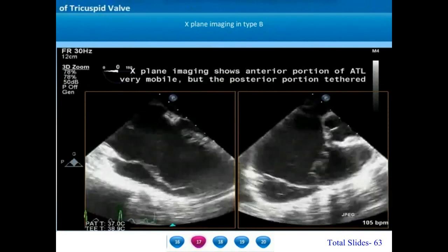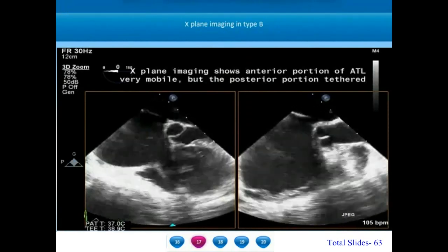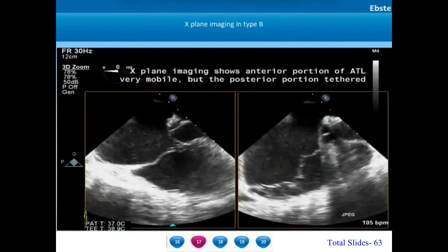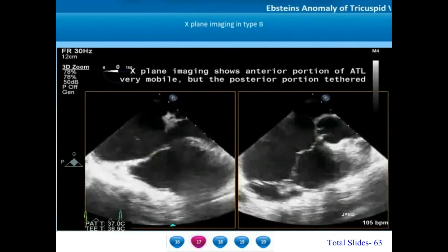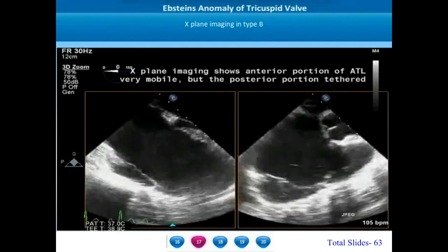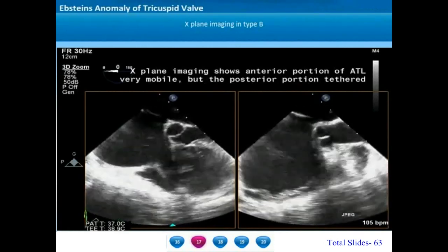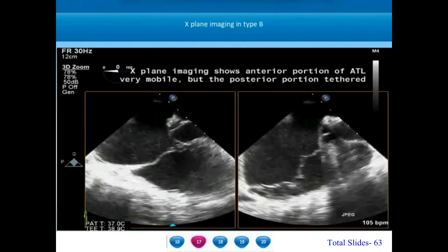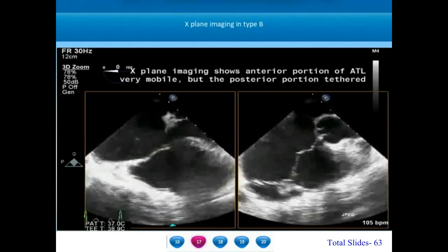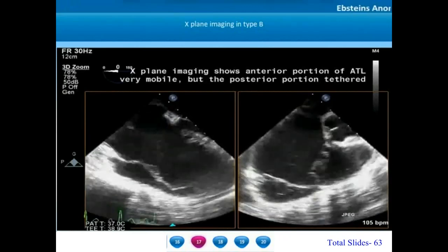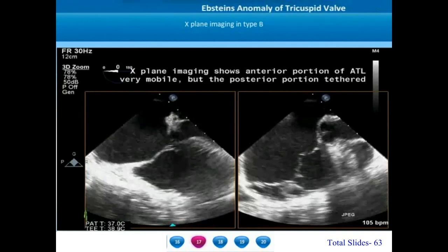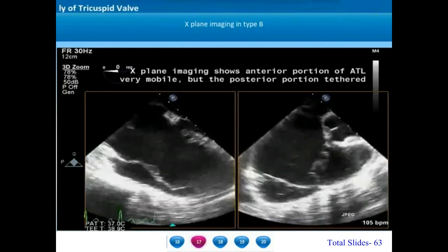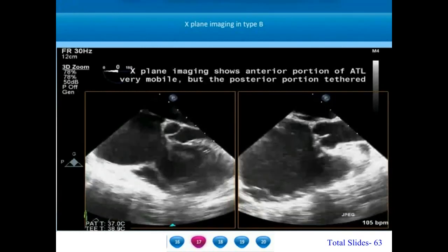When utilizing three-dimensional echo probes, we can use X-plane or cross-plane imaging. In this patient with type B Epstein's anomaly, there is a very good mobility of the anterior tricuspid leaflet seen on the apical four-chamber view. On the left side of the screen at zero degrees, we can appreciate marked mobility of the anterior tricuspid leaflet. However, when we utilize X-plane imaging, we can appreciate that the posterior portions of the ATL are partially tethered. A better understanding of the valve is obtained by using this X-plane imaging.